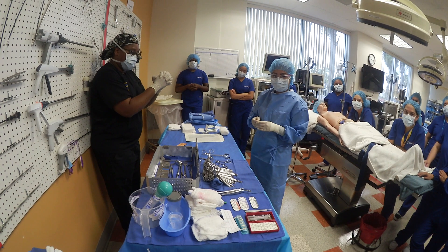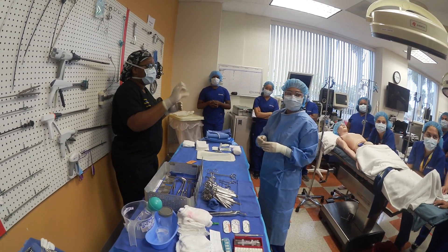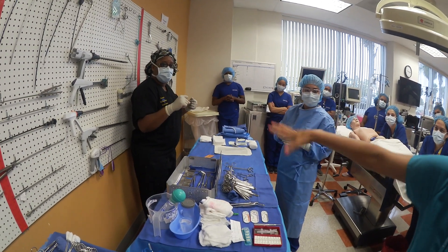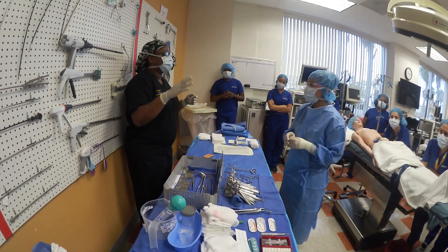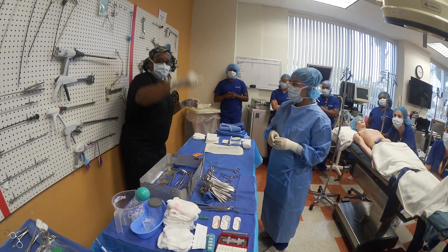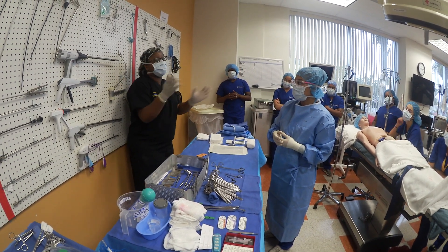Number two: demonstrate hand signal for surgeon requesting a free tie, then pass the free tie to the surgeon. For me, I just like my free ties like this — that's my signal for a free tie. Ms. Alba showed you how she likes hers. Ask Ms. D which one she likes. Each doctor is different — Mr. P's signal is kind of like this, but you have to ask him. When you're with him, he's going to expect you to know what his free tie signal means.